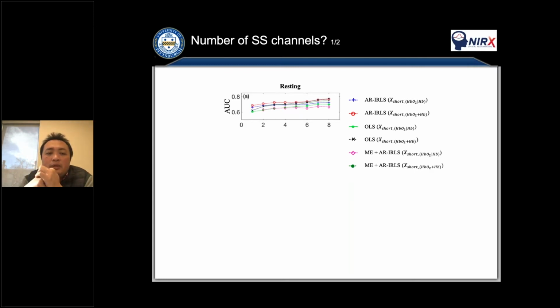So we try to answer that question. If the systemic noise is global, maybe one channel is enough. But that is not the case, because of the blood vessels and geometry of the head. So it is not global anymore, and short channels will be of benefit.